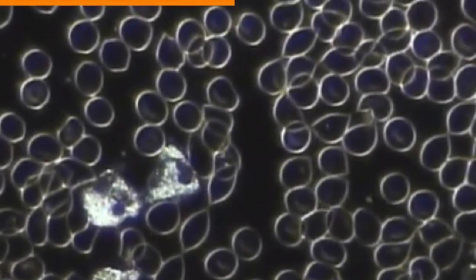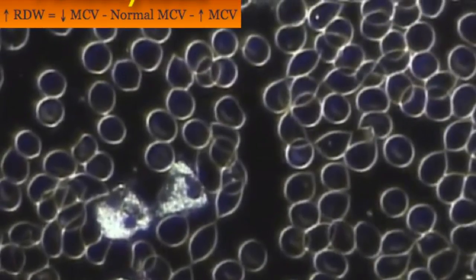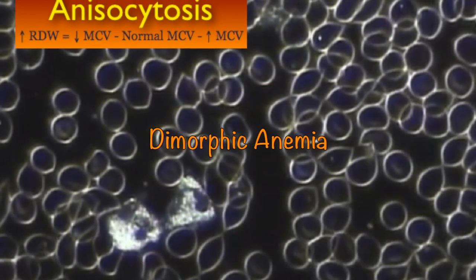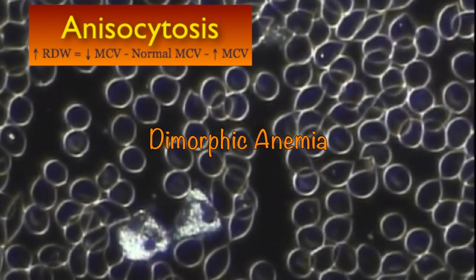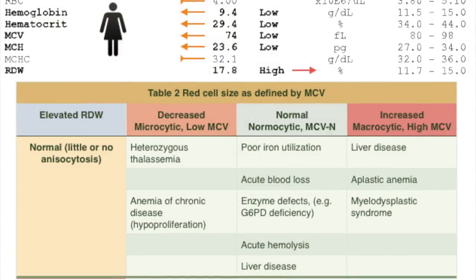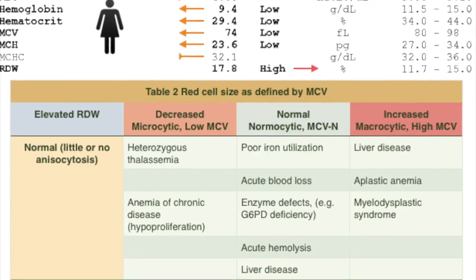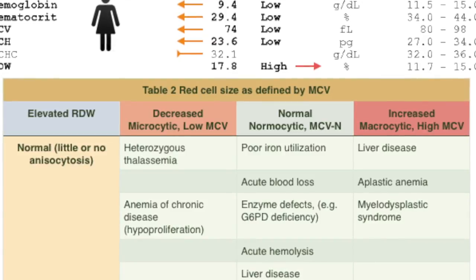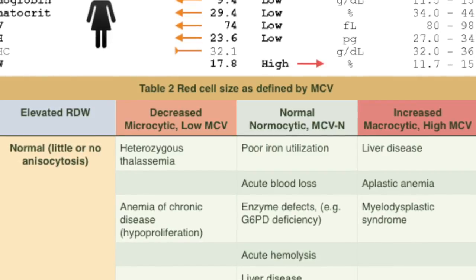Since other red blood cell indices, MCV, MCH, and MCHC, reflect the average values, they may not adequately reflect red blood cell changes where mixed red blood cell populations are present, such as dimorphic red blood cell populations in sideroblastic anemia or combined iron deficiency anemia with decreased MCV and MCH, and megaloblastic anemia with increased MCV. A peripheral blood smear can help you confirm the above findings in these circumstances.